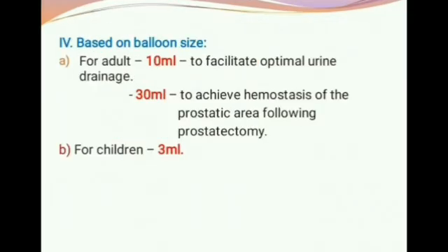Based on balloon size. For adults, 10 ml to facilitate optimal urine drainage. 30 ml to achieve hemostasis of the prostatic area following prostatectomy. For children, 3 ml.